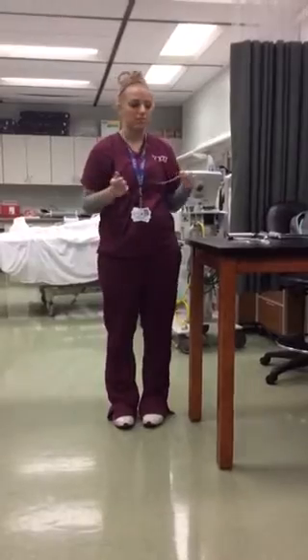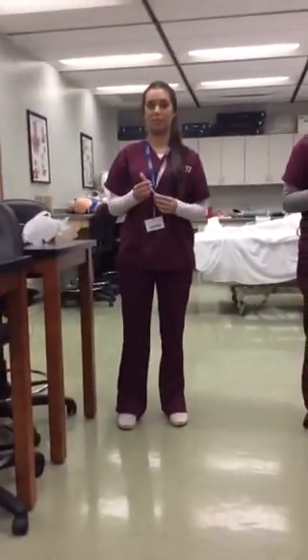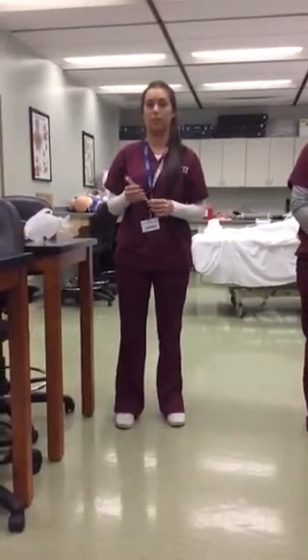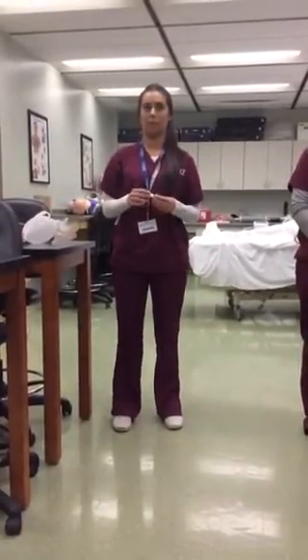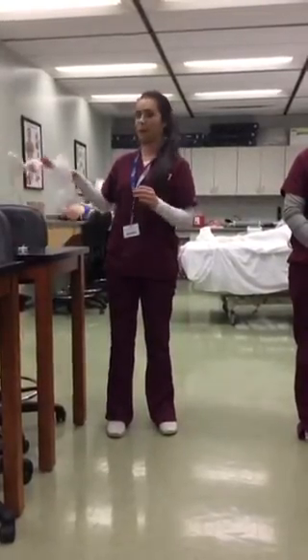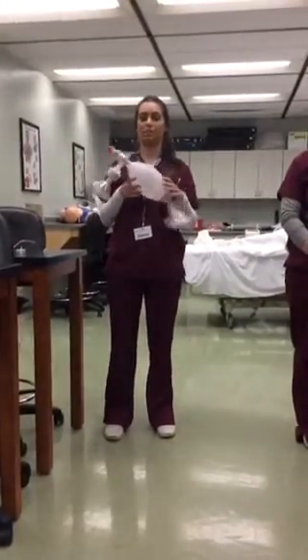This is known as a stylet, which is a rigid device that goes inside the ET tube for easier insertion. This is the syringe. It inflates and deflates the cuff. The average size is a 10 to 12 milliliter syringe. This is the capnometry device. It's a disposable CO2 detector. And this is the bag valve mask used to ventilate the patient.